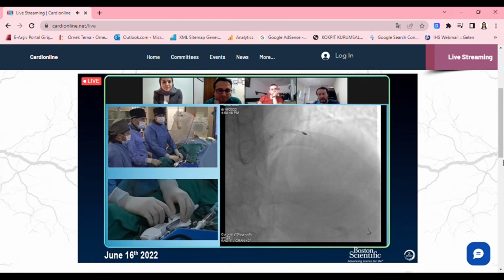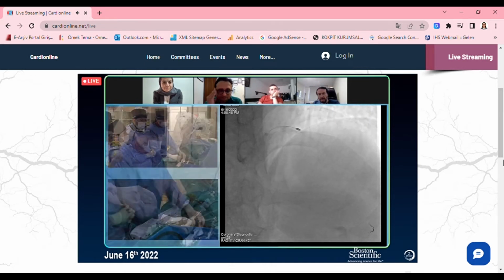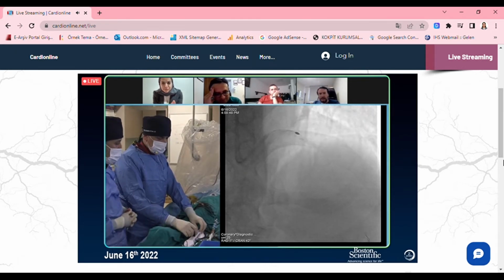Each run has to be 15 seconds. So our pressure is okay. We can give some fluid here.